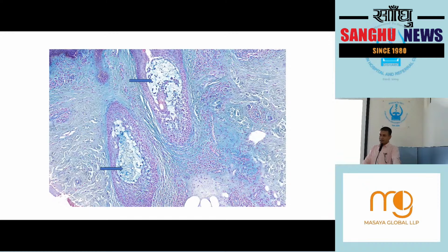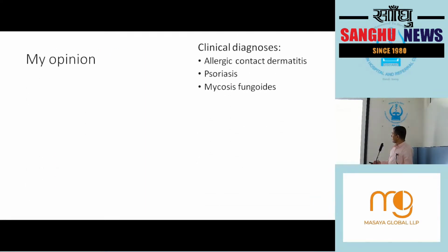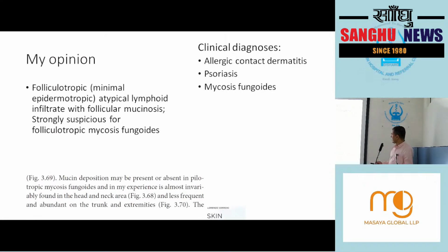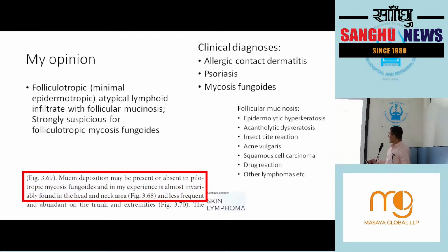This helped me a lot. Because it is a mucin. No more spongiosis. Mucin. Now, these are the differential diagnoses given. These are the differential diagnoses.